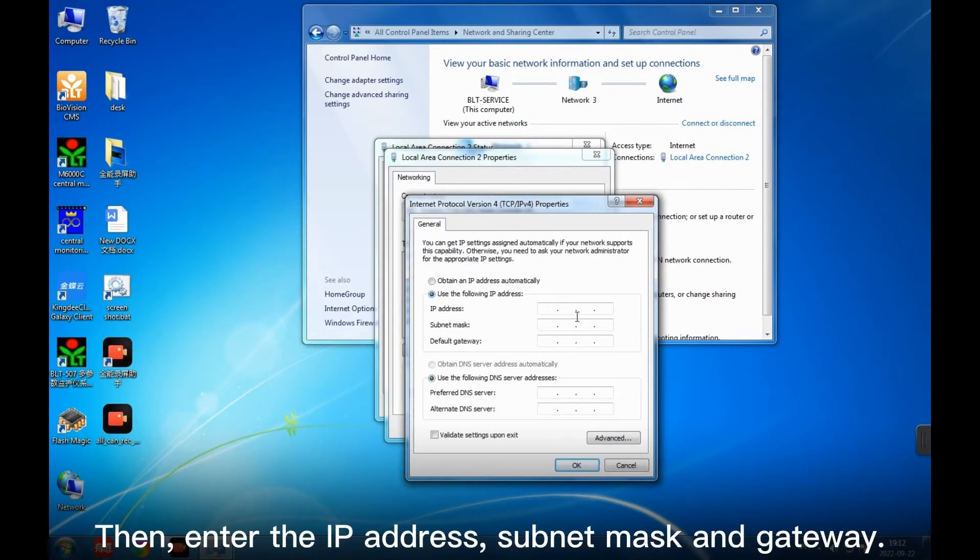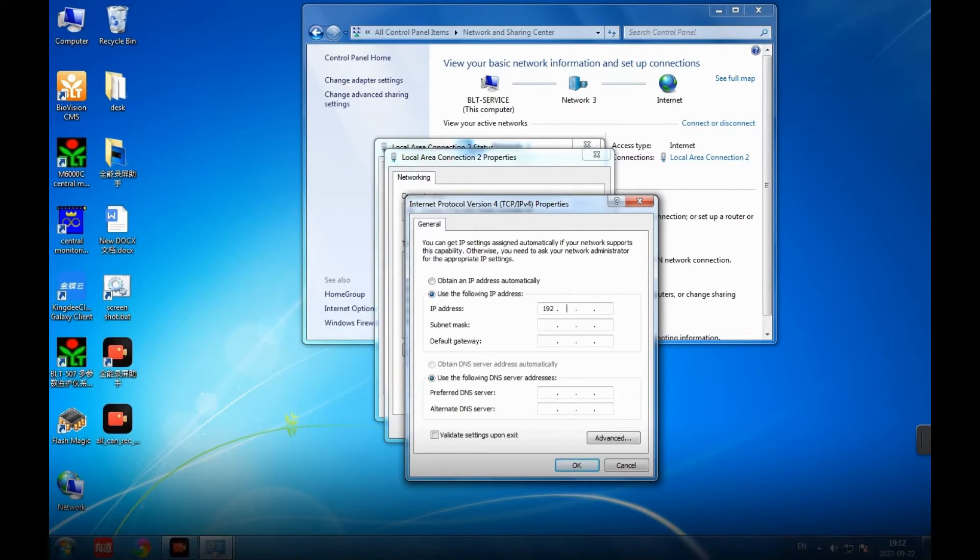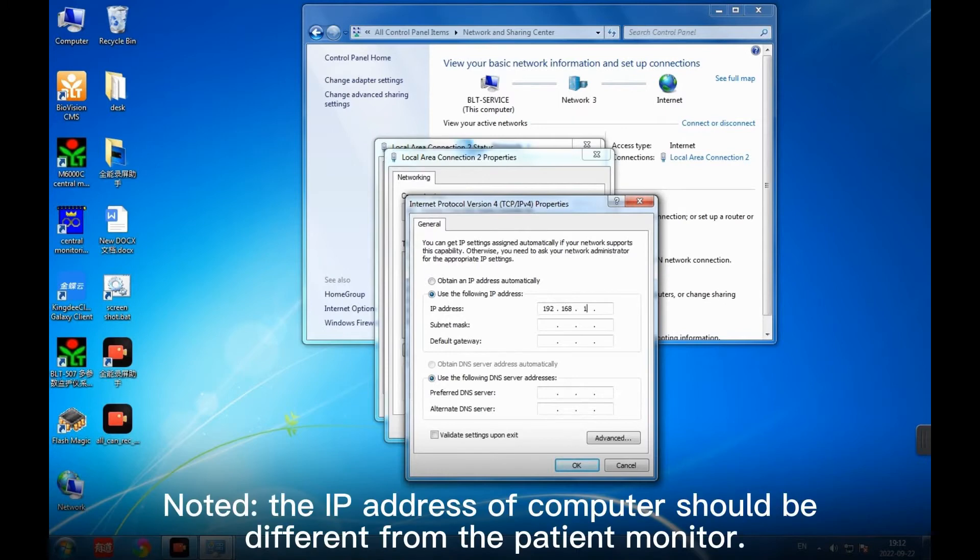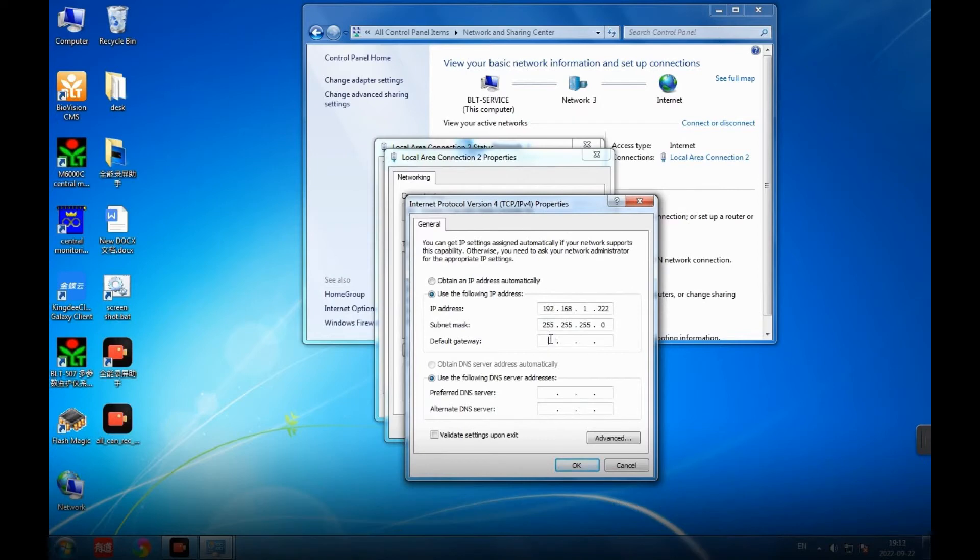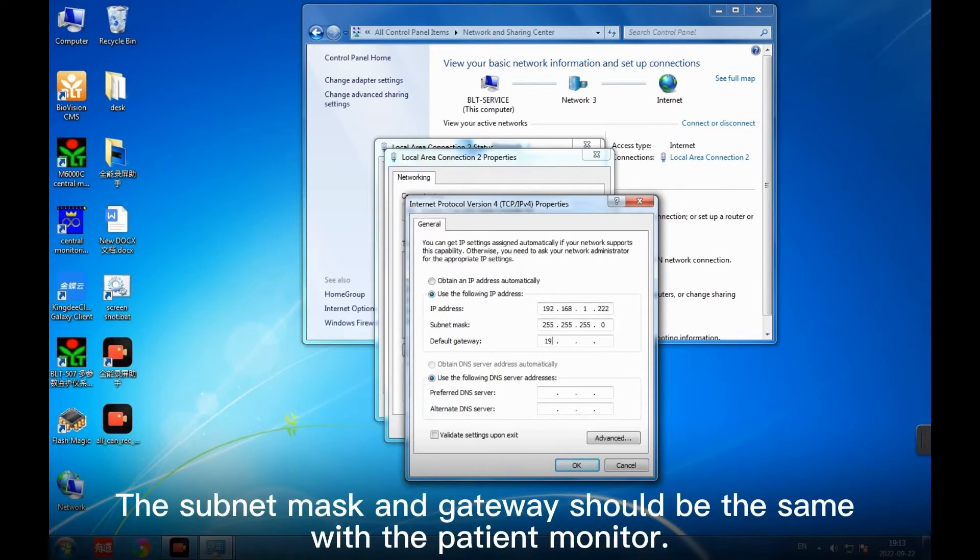Choose Use the following IP address. Then enter the IP address, Subnet Mask and Gateway. Note the IP address of computer should be different from the Patient Monitor. The Subnet Mask and Gateway should be the same with the Patient Monitor.